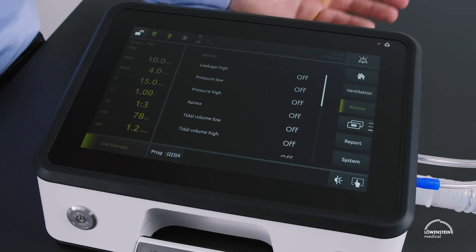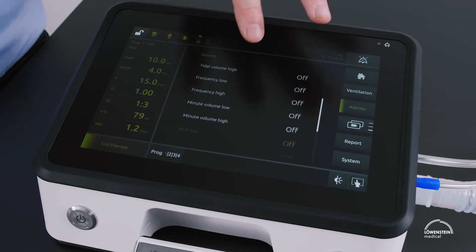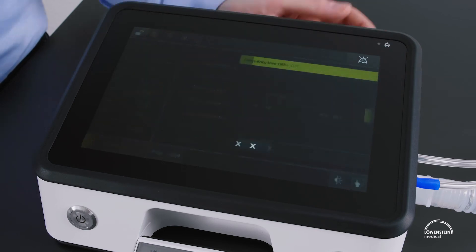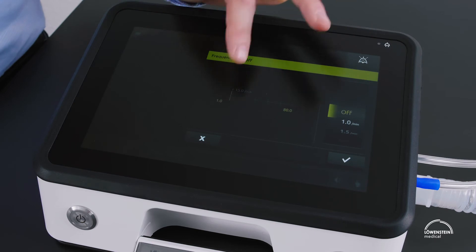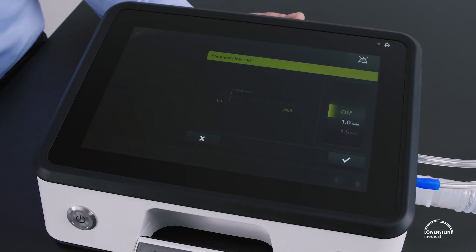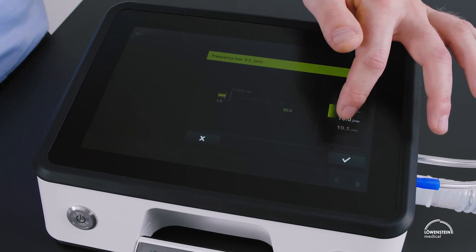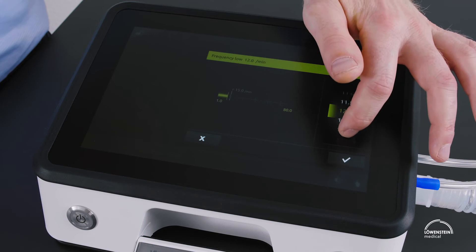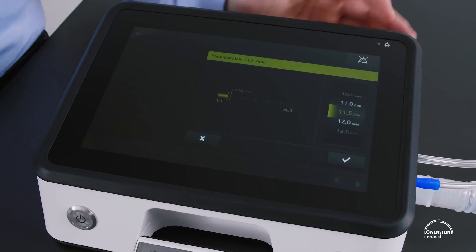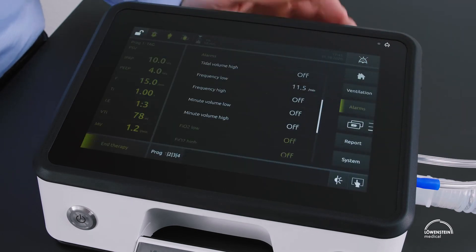After setting the ventilation, we set our alarms. We go into the alarm menu and select the alarm to set, for example frequency low. Displayed in gray is the actual set frequency, and we use the dial to put our alarm in proximity to the actual value. We confirm it and the alarm is set.